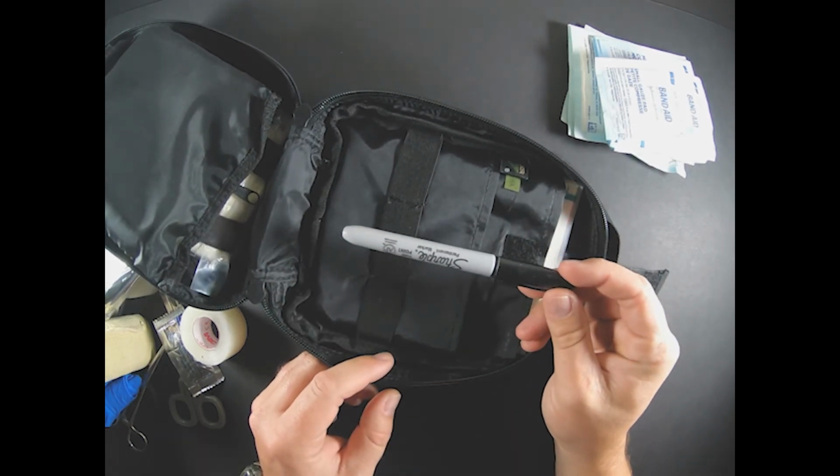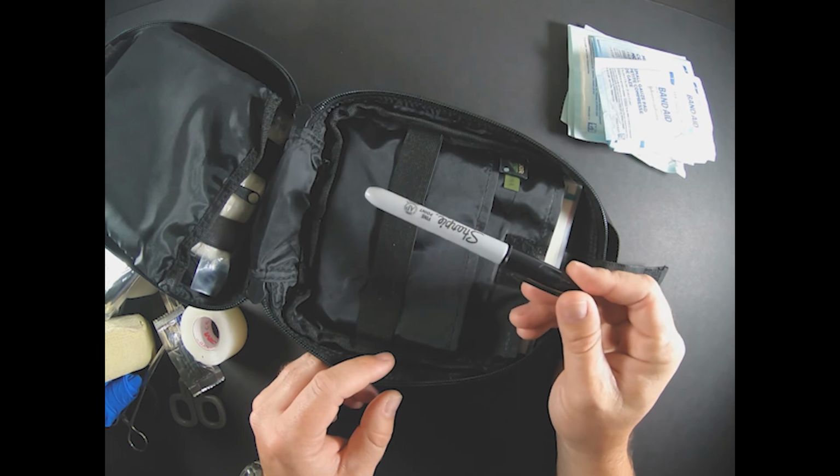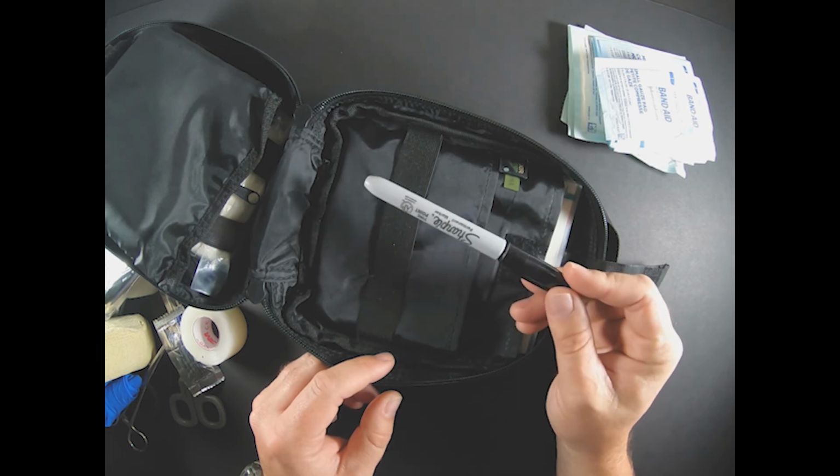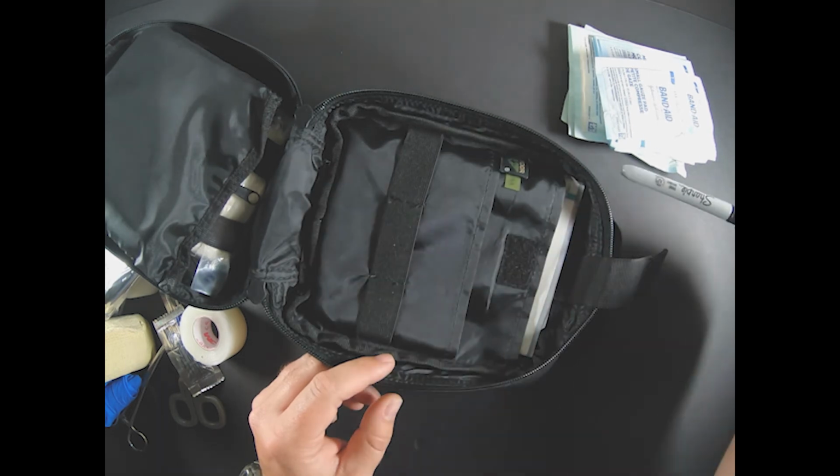A Sharpie marker. This comes in super handy if you have to mark on your patient. You can mark down on their actual skin or clothing or a piece of paper or whatever you could find to document any signs or symptoms, and that way you can monitor if things change. So you've got that going on there.